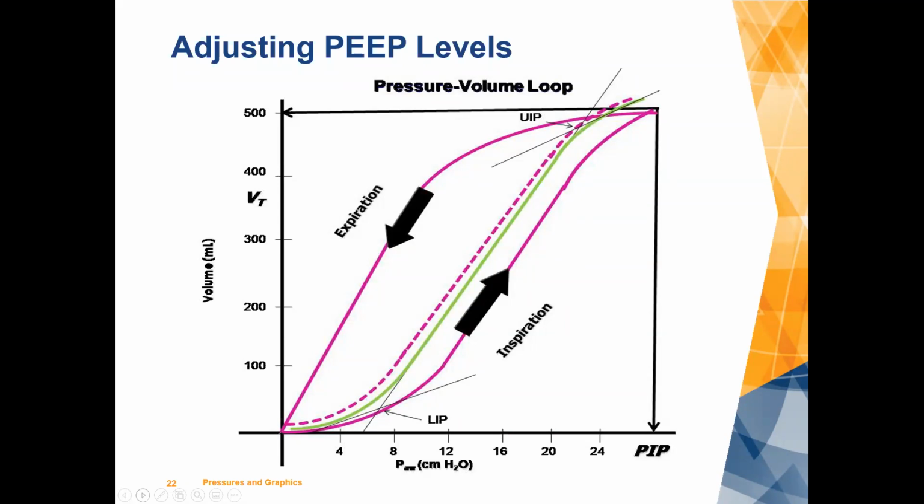Because what we know is that PEEP is not just a tool to enhance oxygenation and prevent atelectasis, okay? It's also a tool so that the lungs don't empty and you reduce the shearing pressures. So you reduce those shearing pressures that can actually cause or worsen an inflammatory cascade that can ultimately end up in a stiffer lung, contribute to ARDS.